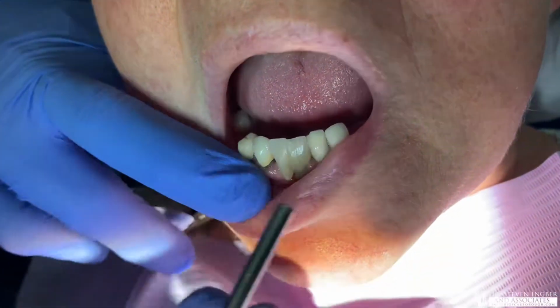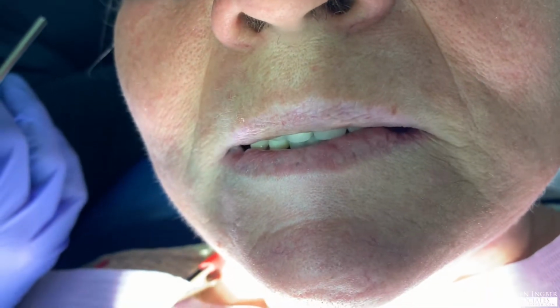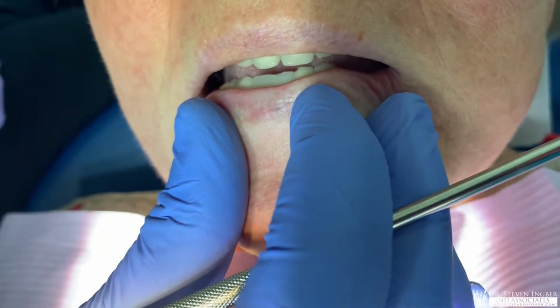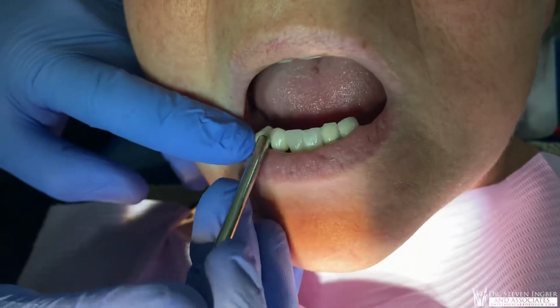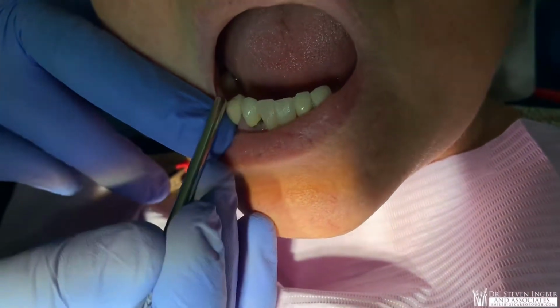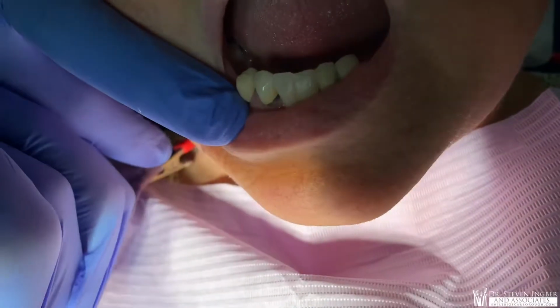So what an amazing, I think this is a great result, because when she smiles in public, smile for us, Elizabeth. Big smile, come on. That's what she sees. Is anybody going to know that that's fake teeth? Absolutely not. Now, another thing that I do purposely is I make the edges of the teeth whiter. Why? Because if any of this dentistry fails in the future, which it probably will, when I redo it, I'm going to do it in a whiter tooth color, right? And then it'll start matching up a little bit better, be more pleasing for her.